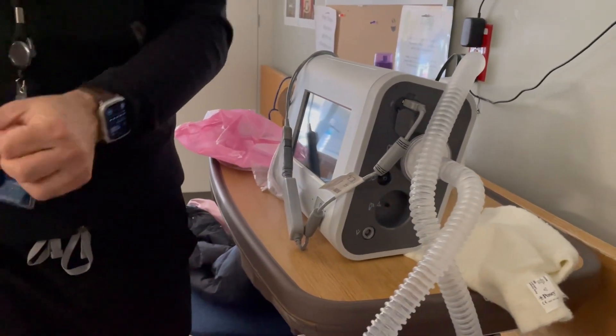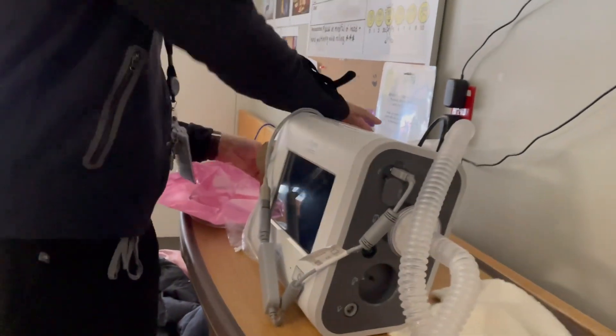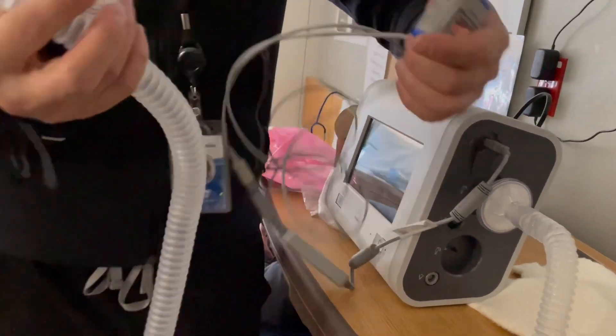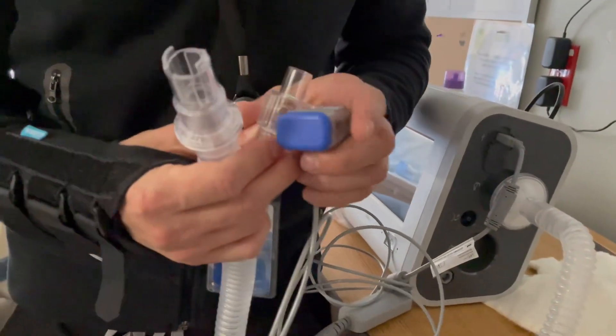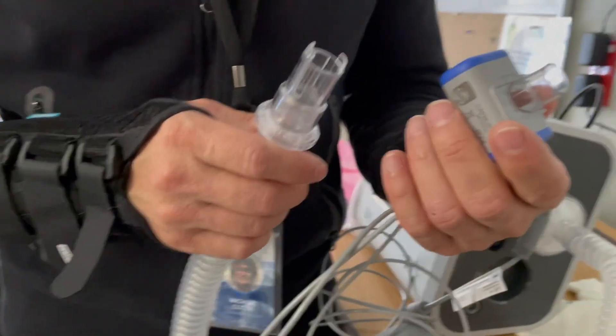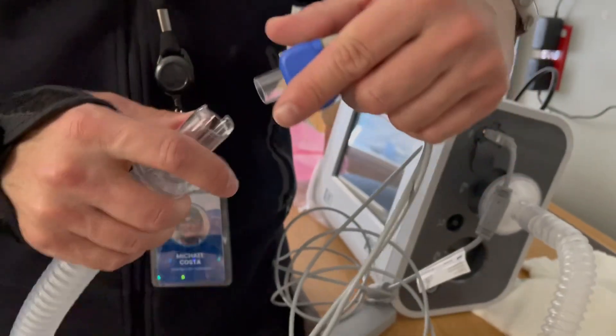The end-tidal adapter piece — and this is where I'm going to learn from you guys, because this is the first time I've actually used this device. This piece is like so.